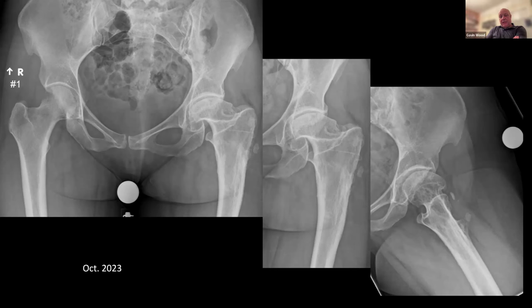And so for me, this would be a bit of a challenge trying to get a cementless stem down here because of the metaphyseal diaphyseal mismatch, poor bone quality, and that abnormal varus deformity. I don't think you need to do a corrective osteotomy. But for me here, I'd definitely be using a cemented stem. It would give me a lot more versatility for offset, depth of stem insertion, etc., independent of that poor quality bone as well as the odd metaphysis and mild varus deformity.